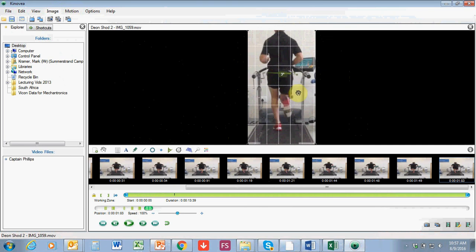If you look at, again, this arm is a little bit closer than this arm was on the previous stance phase. Since this is still a basic evaluation, I'm not going to go into the actual distances, but we will be able to determine exactly how far this elbow is from the midline of the spine and give us more objective numerical data in order to quantify exactly what that distance is. But for now, this is just an introduction. Again, I'm trying to screen capture this, compare left to right side in terms of stability.